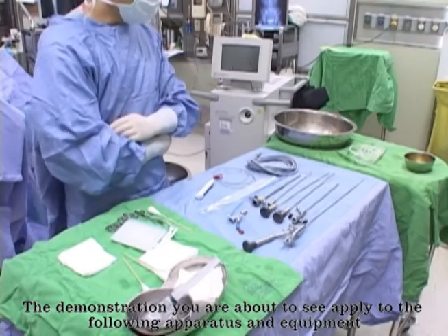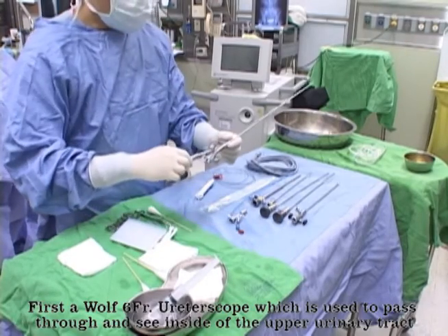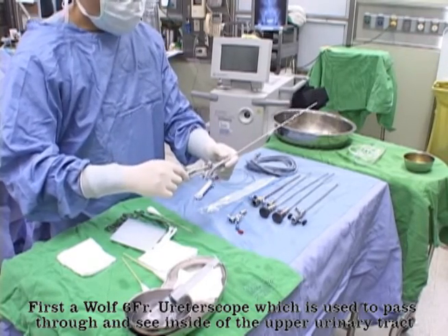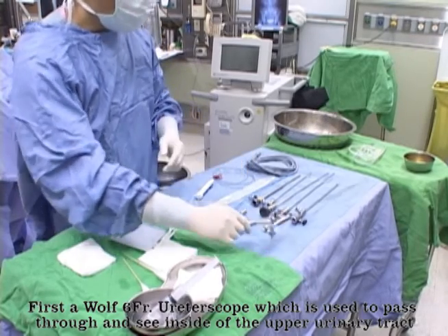The demonstration you are about to see applies to the following apparatus and equipment. First, a Wolf 6 Fr. Ureteroscope, which is used to pass through and see inside of the upper urinary tract.